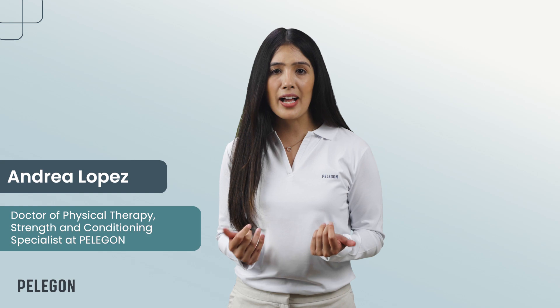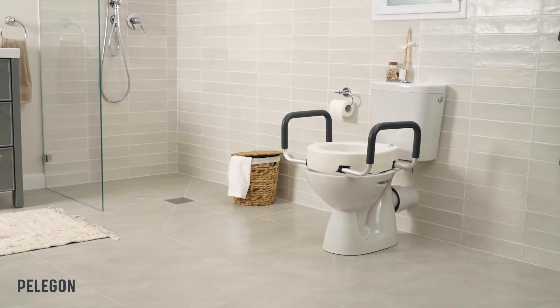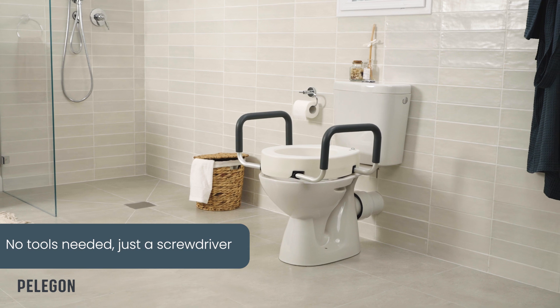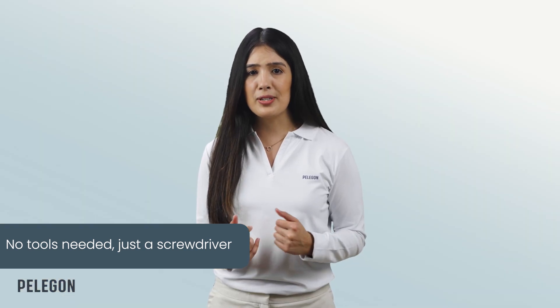Hi everyone, I'm Andrea, a doctor of physical therapy, and today I'll be showing you how to assemble your Pelegon raised toilet seat correctly. What is great about this product is that no tools are needed to assemble it, other than the screwdriver and the pieces from your package. So let's get started.